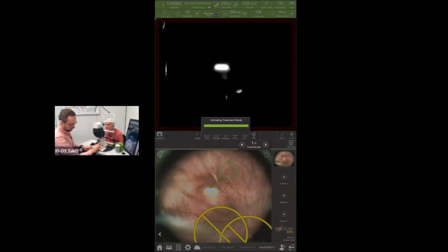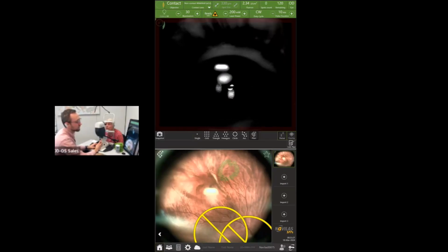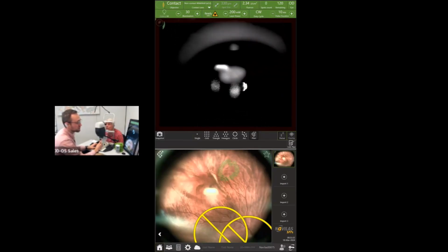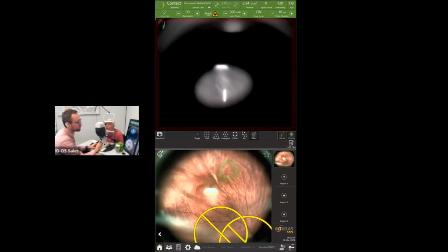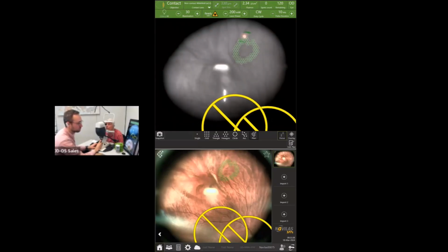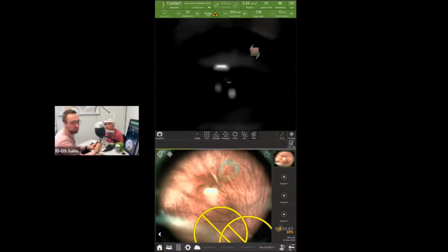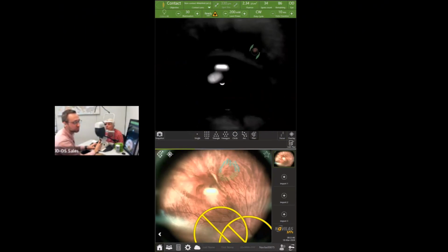Again, I remind you that the patient does not have any pupil dilation, so I activate the laser system in simulation mode, slowly pushing the base towards the patient until I see the retina reflex. I centrate on this retina reflex. I centrate the camera. Do not confuse the retina reflex and the camera reflex, and also the focusing lines. And you can see the plan is being projected on the retina, and the spots are being delivered.